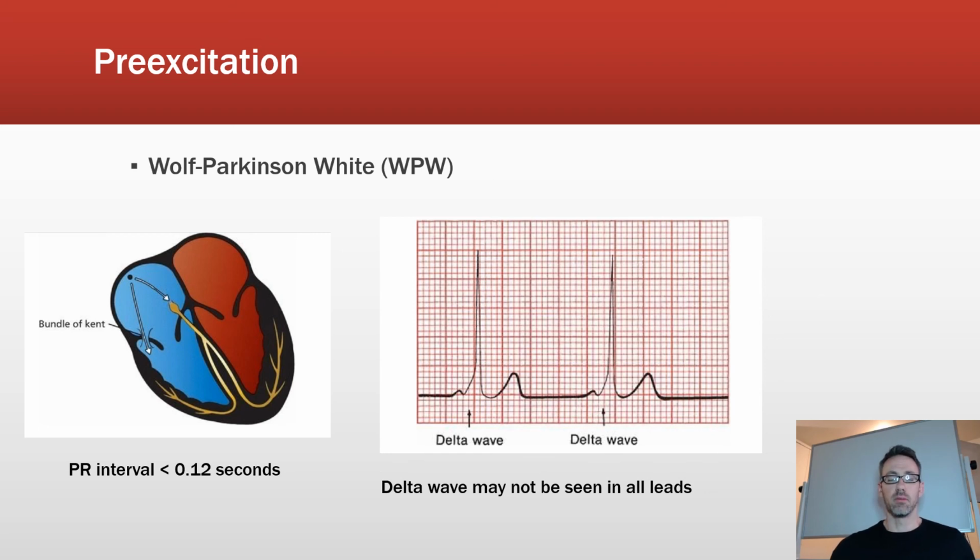Wolff-Parkinson-White is essentially a reentry loop, but a very large reentry loop. So we've talked about reentry loops wherein you have small little racetracks, if you will, in multiple spots in the atria when we're talking about AFib, or around the tricuspid when we're talking about atrial flutter, or within the AV node if we're talking about PSVT, for example. This can also create this electrical racetrack again.